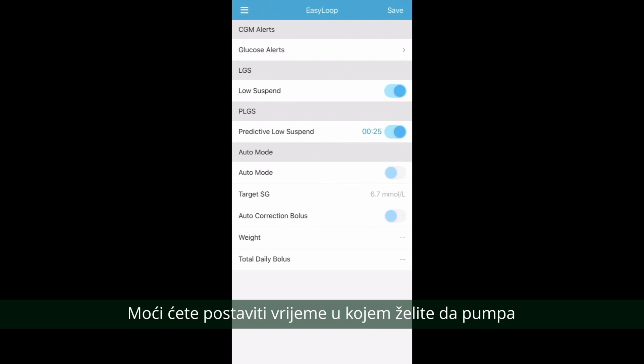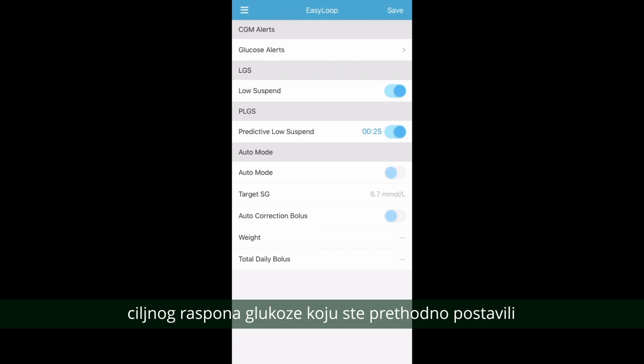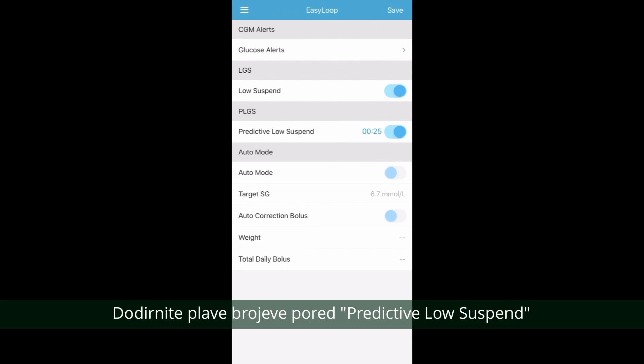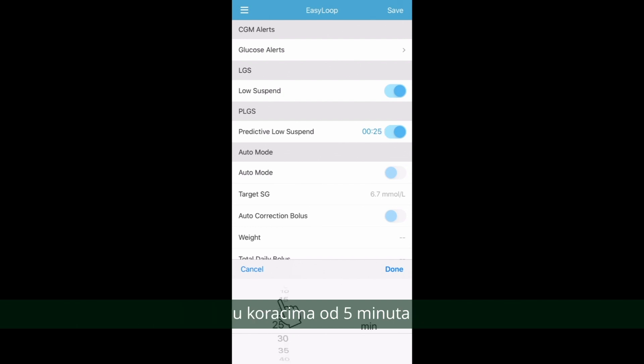You will now be able to set a time you wish the pump to suspend the delivery of insulin before it reaches your low limit that you have previously set. Tap on the blue numbers next to Predictive Low Suspend. You can set this anywhere from 5 minutes to 40 minutes with 5 minute increments.